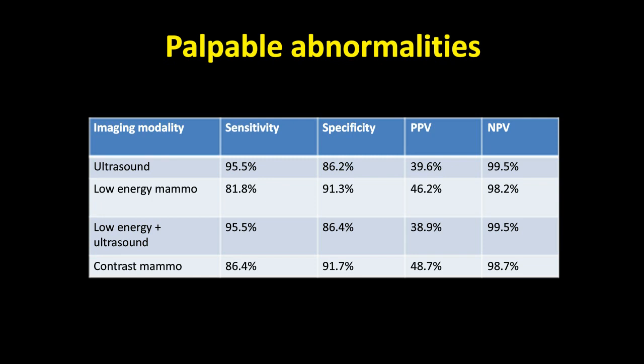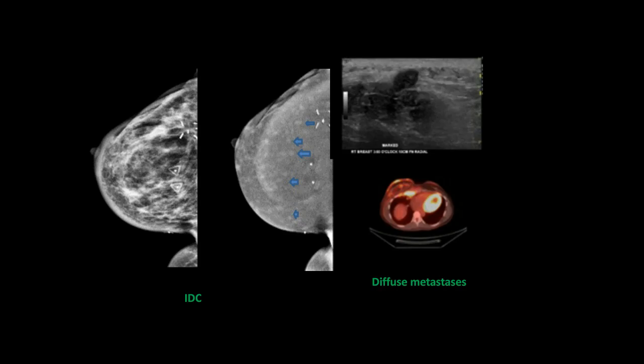So what we concluded is that although doing mammography and ultrasound is quite sensitive without adding the contrast, using the contrast may enable us to avoid biopsying women who have benign appearing lesions on ultrasound that do not enhance. Here is a couple examples from the study.